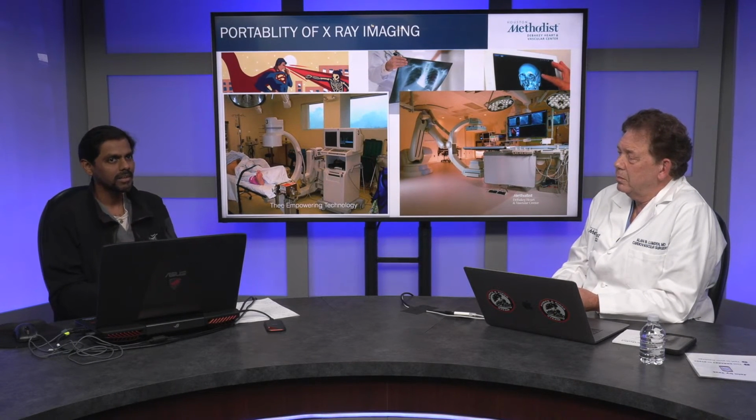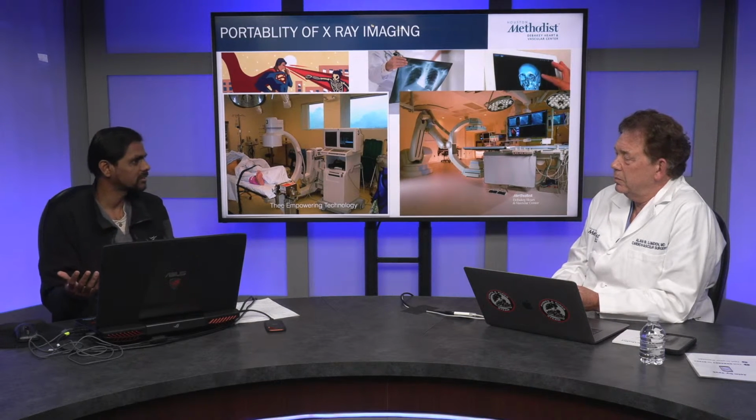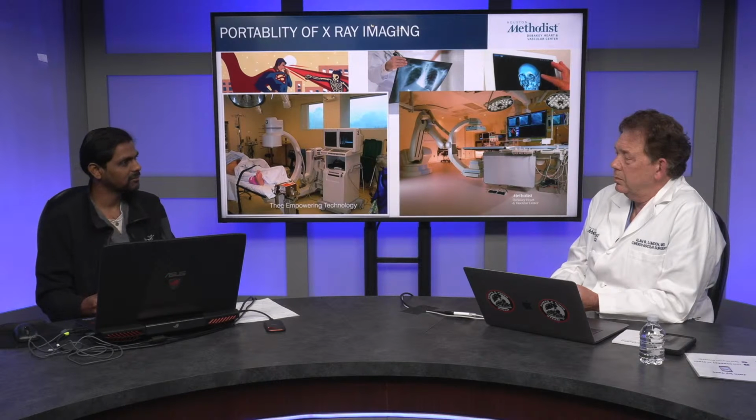And nowadays, imaging is much more miniaturized than it was 20, 30 years ago. The ultrasound imaging has really evolved a lot. So I sense a lot of opportunity to bring more and more imaging into the operating rooms, so that these procedures are converted from maximally invasive to minimally invasive therapies, which eventually will improve patient care.